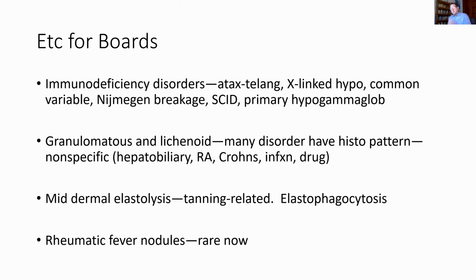But know that what we seem to be seeing in our practice is generally secondary syphilis with this pattern. And the clue for that, and so he does have the infection here, so secondary syphilis falls in this, is that essentially always they have plasma cells. So plasma cells are helpful, and the immunostain for the spirochetes works really, really well. I couldn't find an example, though I know I've read them in our archive. I've read a couple of these, but it must have been longer ago than I thought.